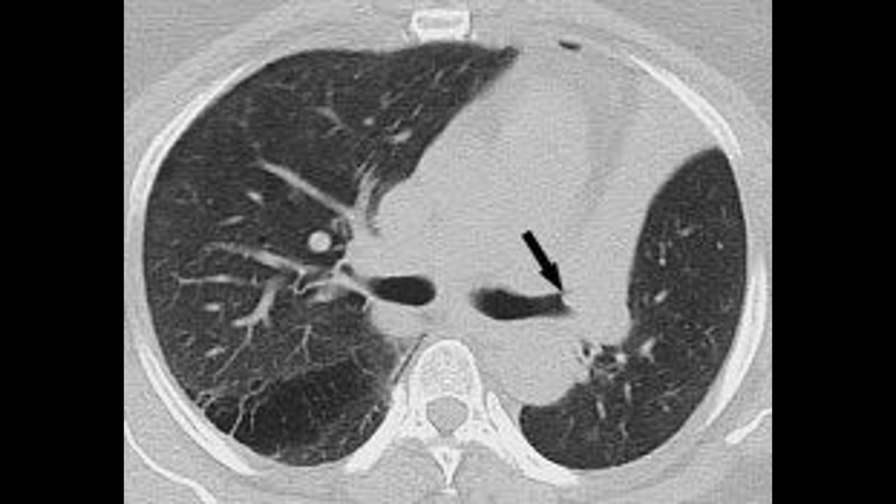The main cause of left upper lobe collapse in adults is endobronchial obstruction, most commonly due to malignancy. Though mucus plugging can occasionally cause this pattern, in the absence of another clear explanation, malignancy must always be presumed until proven otherwise. In this case, bronchoscopy following CT confirmed a centrally obstructing squamous cell carcinoma.